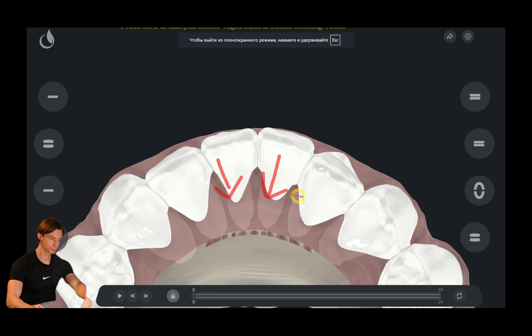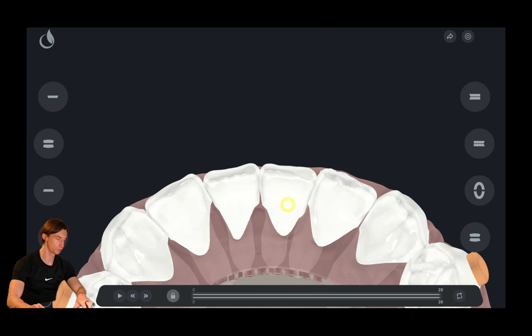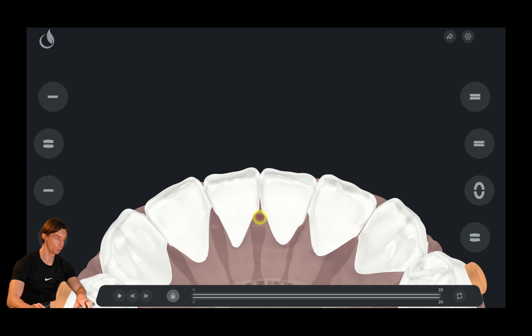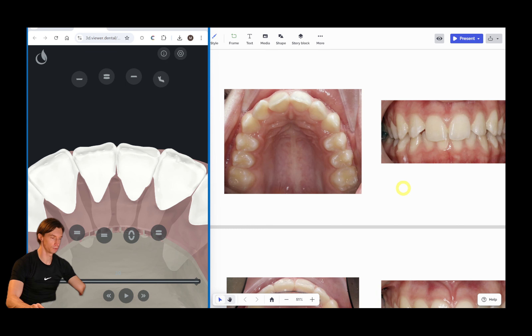Looking at the lower arch, we also cannot start moving the teeth lingually from the start because there is just no space. First of all, we proclinate the teeth, create some gaps, and retract them, distributing the space evenly between all the frontal teeth so that we don't strip too much of any of the surfaces.